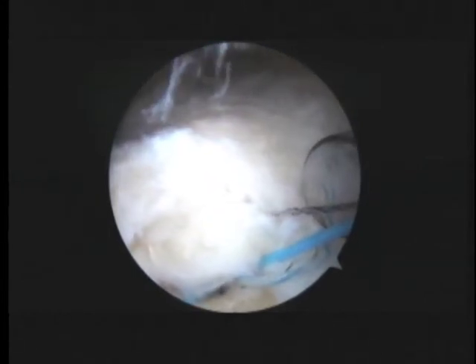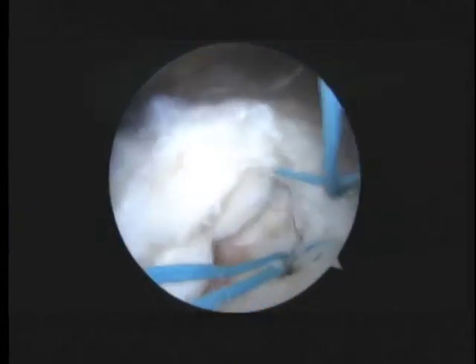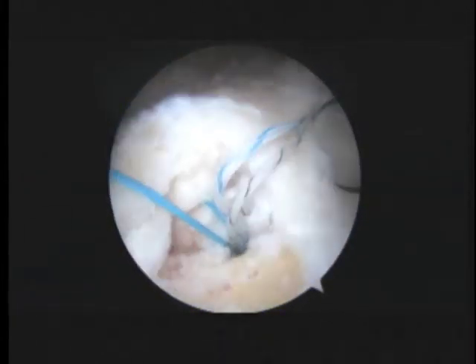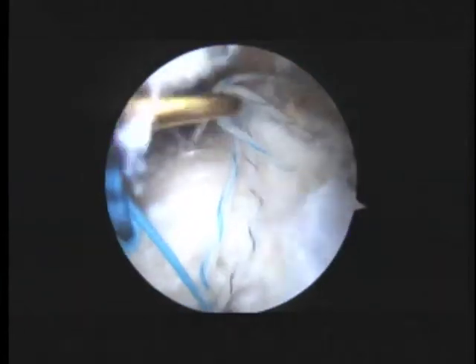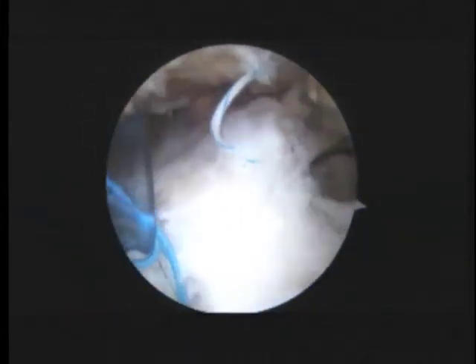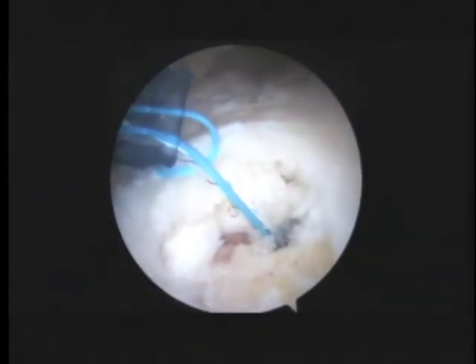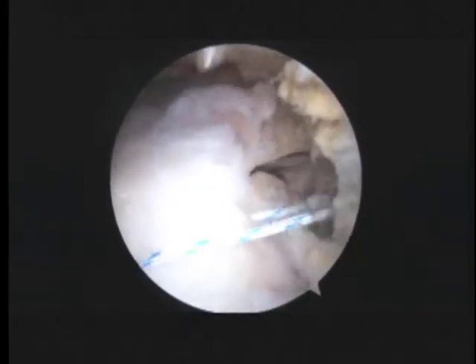Hold the cannula on the arms. And now we'll pull that back. So now the next step is we have to gather all the sutures in the front before we start tying them. This one here. So we're going to go ahead and tie these knots here. We'll show you some more in just a minute.